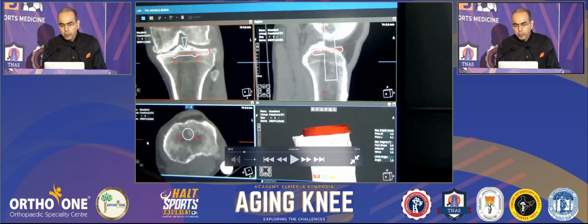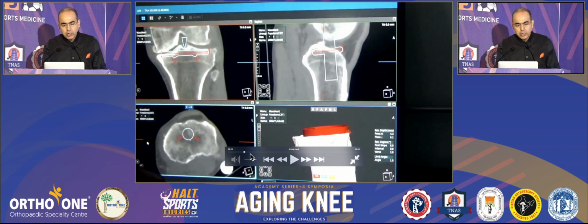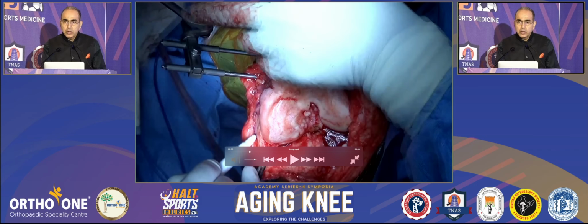The slope is 6. Why is it okay? Because you can see here that the lateral cut is 6.1 and the medial is 4.3. So once we account for the cartilage loss, it's an equal cut. So basically, equal distal lateral, equal distal medial, equal posterior medial, equal posterior lateral, and the tibia cut equal from the tibial spine. Once we get that right, there is no need for any ligament release.